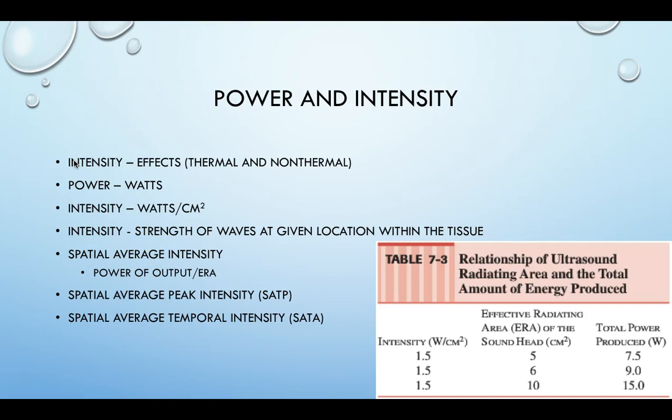If we have our settings low enough, however, we can apply the energy at a level that has very little thermal effects, and the body can then diffuse that energy and that thermal increase out of the tissue, so that we essentially get no increase in temperature. But then that maximizes the non-thermal effects that we get.